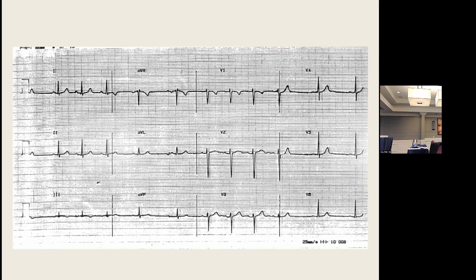Here, the reason this is sinus arrhythmia is you're watching this go, and look at the R complexes, R wave, R wave. Well, now it's shorter, now it's narrow, that's the same, now it's wider again. You might say atrial fibrillation, but look at the P waves. Every one of these QRSs is preceded by a P wave. And the presence of discernible P waves makes this a sinus arrhythmia.